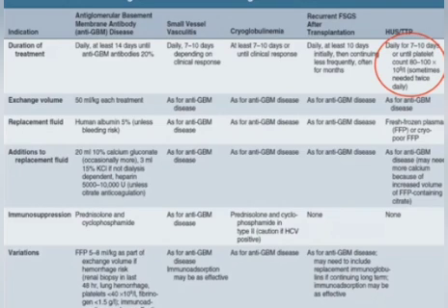I remember a case we performed, a young man with severe TTP, and the guy had a platelet count of 5,000 or 10,000, not more, and he received up to 20 sessions in almost 14 days till his platelet count improved.